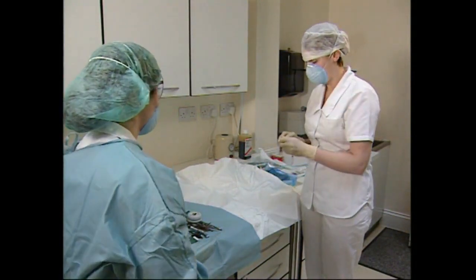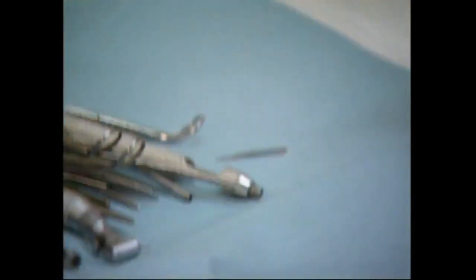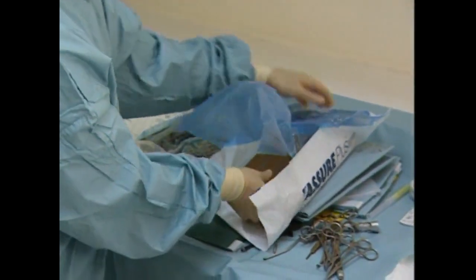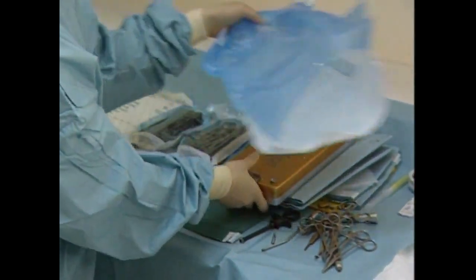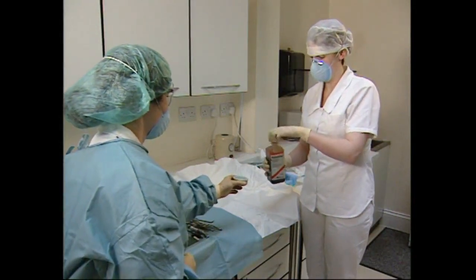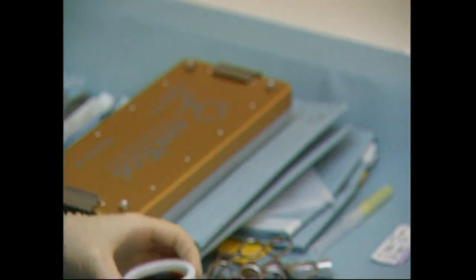The roving assistant always opens the non-sterile outer packing, handing over or dropping the sterile inner instrument or pack. In this way, syringes, blades and sutures as well as larger packs such as implant insertion kits can be passed over. Betadine solution to be used for the patient skin preparation is poured into a porcelain dish without the dispenser coming into contact with the dish.